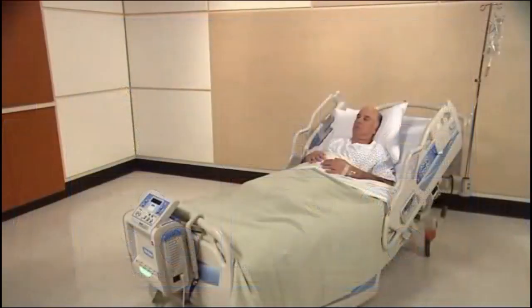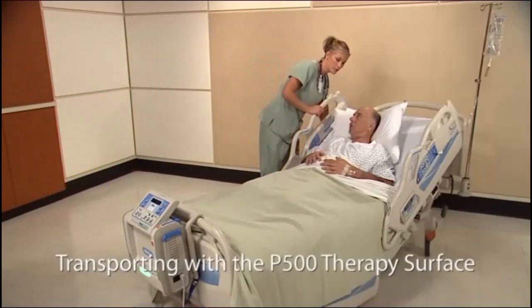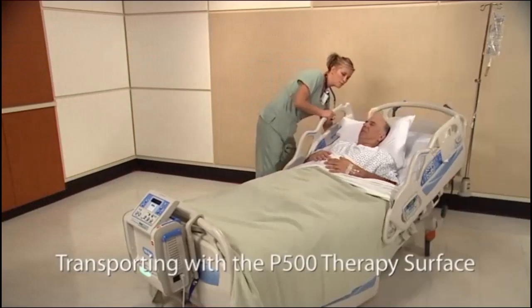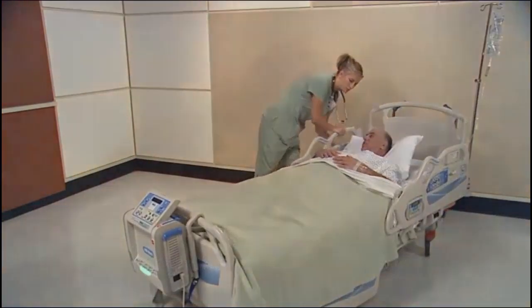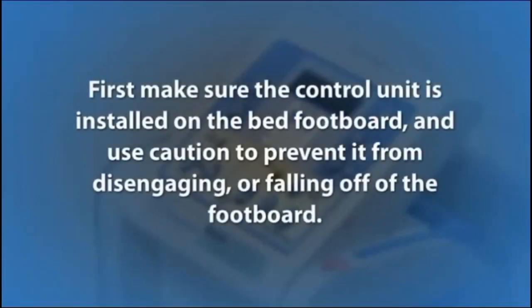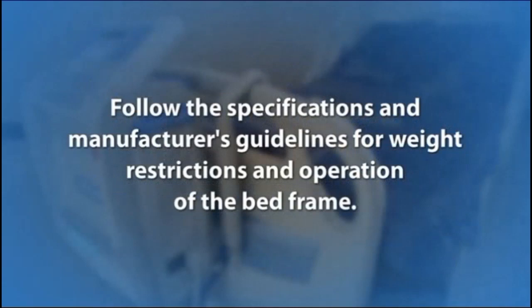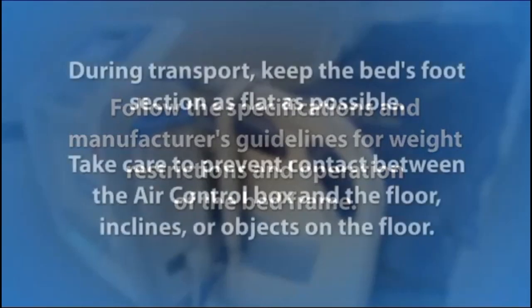To transport a patient on a frame with a P500 Therapy Surface, please follow these instructions, which can also be found in the user manual. First, make sure the control unit is installed on the bed footboard, and use caution to prevent it from disengaging or falling off of the footboard. Follow the specifications and manufacturer's guidelines for weight restrictions and operation of the bed frame.